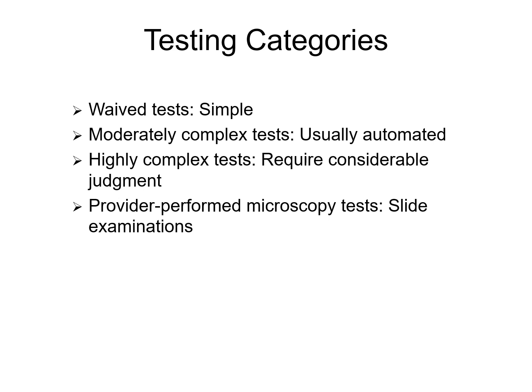So examples would be like a wet mount or other microscopy type based assay. The requirement is it has to be a provider, so a nurse practitioner, a doctor, people like that, and they must be trained in slide interpretation. So best practices for this is to always perform tests within the scope of personnel training and certification. Make sure to follow CLSI and regulatory guidelines for each complexity level, and maintain proper documentation of test results and observations.